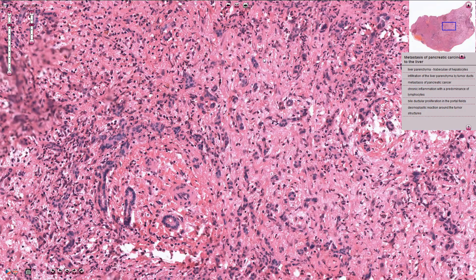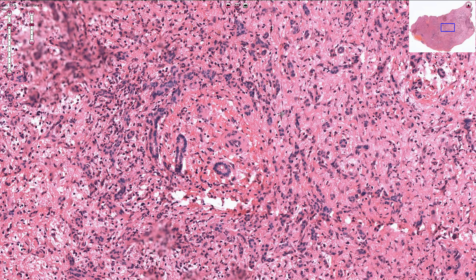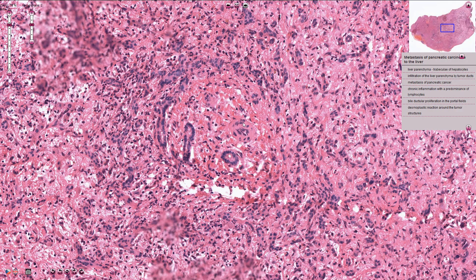In this part of the tumor we can see the infiltrative glandular component again with prominent fibrous tissue. This is the blood vessel here, and here we have reactive bile ducts. Those are not malignant structures.